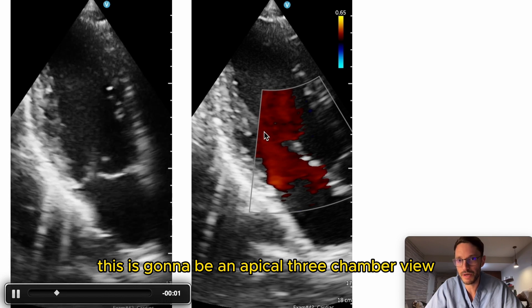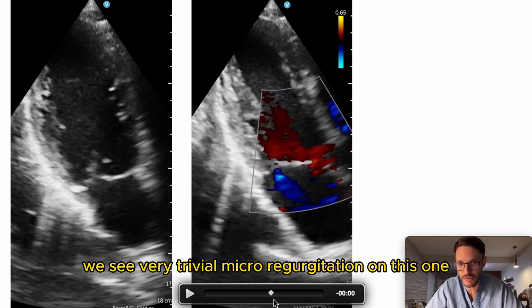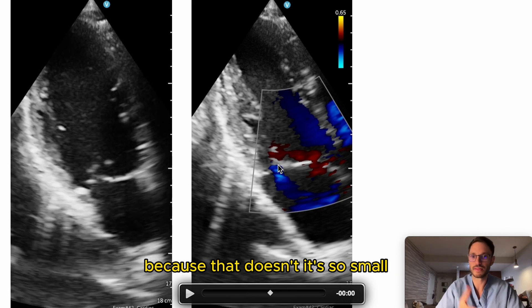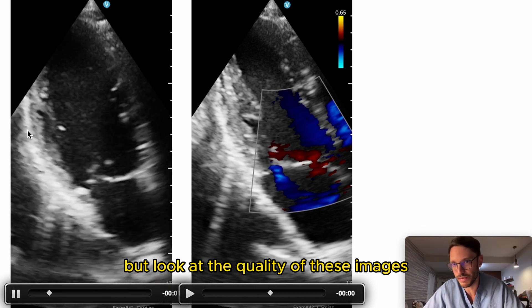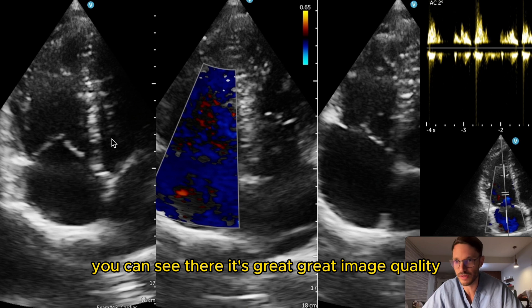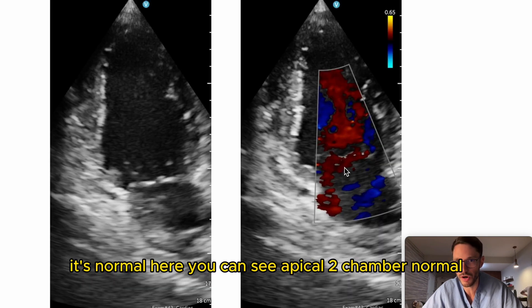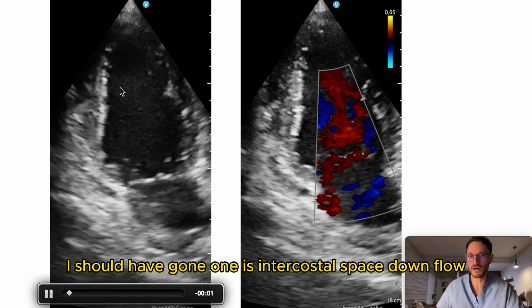This is an apical three-chamber view where we see very trivial mitral regurgitation. You can't even calculate a vena contracta because it's so small — per recommendation, you shouldn't for jets this trivial. Look at the image quality though. Now focusing on the right ventricle — great image quality — and here are measurements of the right ventricle with the calipers, which are normal.